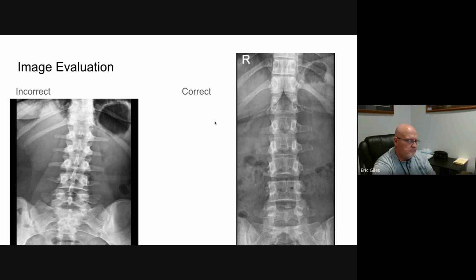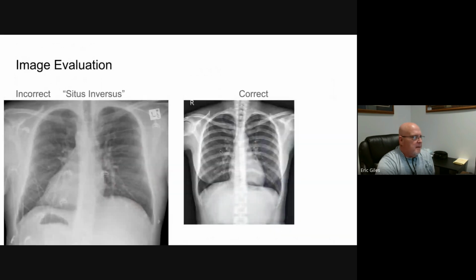Okay. Good job on those images, guys, whoever did them. Anyway, that's all I got today. I am sorry if any of that came across confusing. That definitely wasn't my intention. However, just look at that. Get you a skeleton guy and put him by your machine and try to make your x-ray look like skeleton dude looking at you. Okay, except for fingers and feet. They're a little bit different just because the fingers are up and the toes are up. Okay.